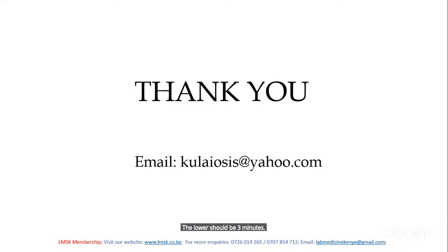If you go high, 5 minutes, not longer with the duration, and not high speed. 3,000 revolutions per minute for 3 or a maximum of 5 minutes, because a higher speed and longer will lyse the cells. Thank you. Great, that's wonderful. Thank you very much for that.